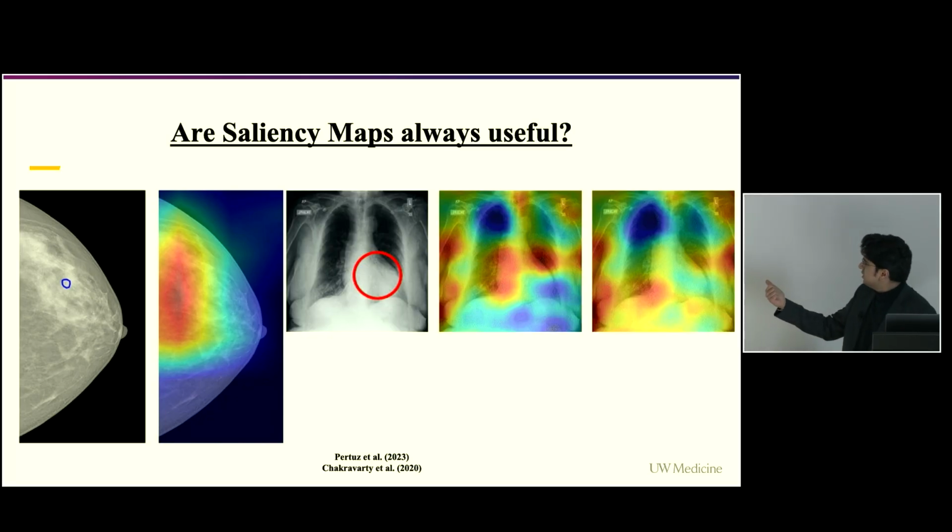How about this? Do we think this is interpretable? Can a saliency map like this help clinicians? How many of us feel that? Not even one hand. Why? We just established that saliency maps are beautiful. Like, they are the most amazing thing that deep learning researchers could have created. And now there are no hands. Why? It looks like it is highlighting all over the place. Is every region important? What is the most meaningful clinical attribute that can be extracted from this image?